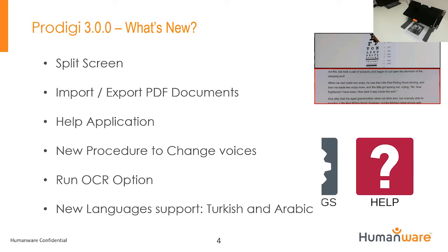Help application, new procedure also to change voices. This new procedure has been put in place in Prodigy 3.0 to have a solid foundation in order to add some more voices, because right now there's only a limit of 2 voices that can be installed and used on Prodigy. This new procedure will help us in future versions to add more voices, up to 4 voices. That's what we're aiming for, to be able to install and use more than 2 voice packages.